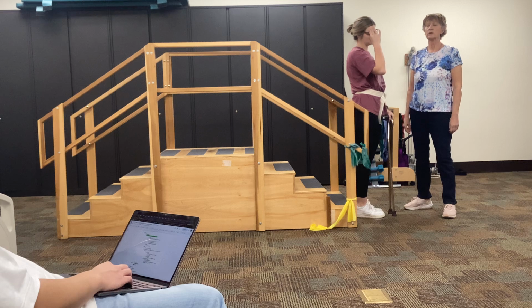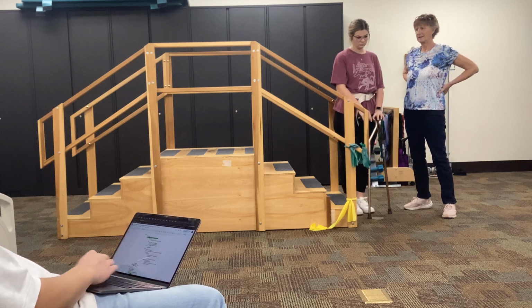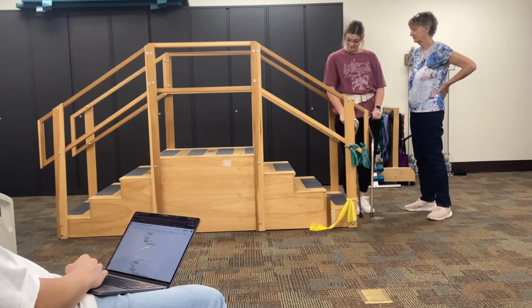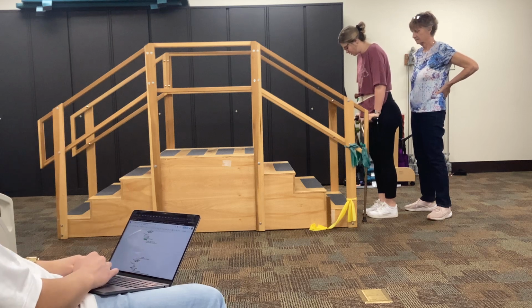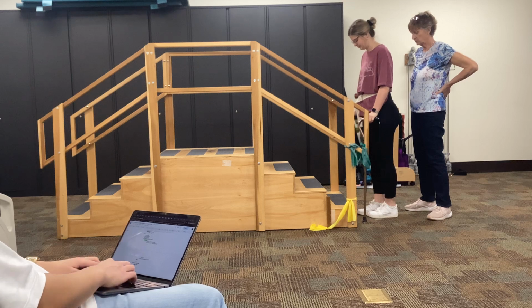All right, so now you are ambulating with a 4-point gait. How do you think you're going to go up the stairs? Same way you walk. Cane, foot, cane, foot. Give it a try.